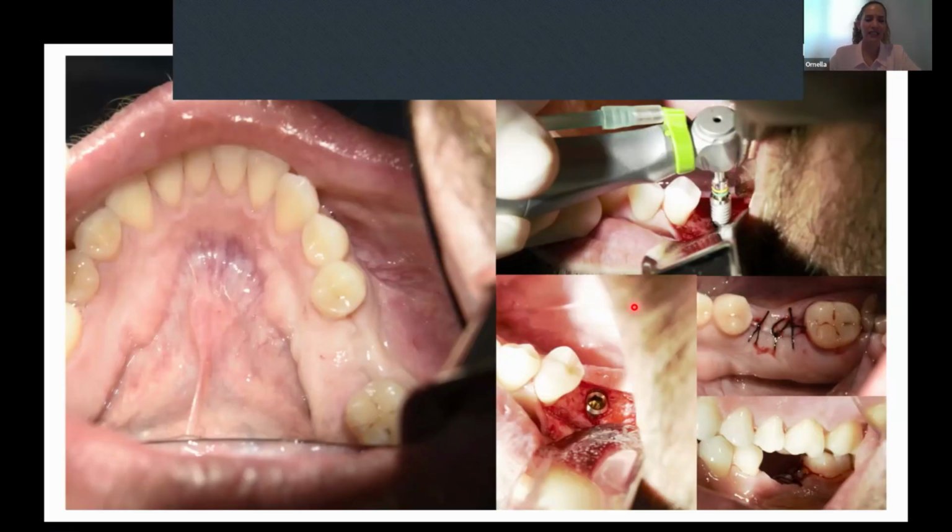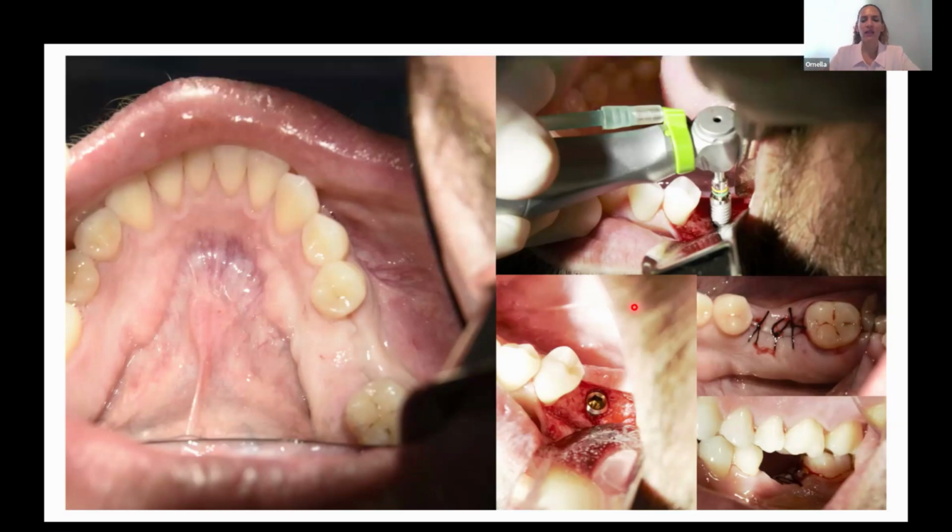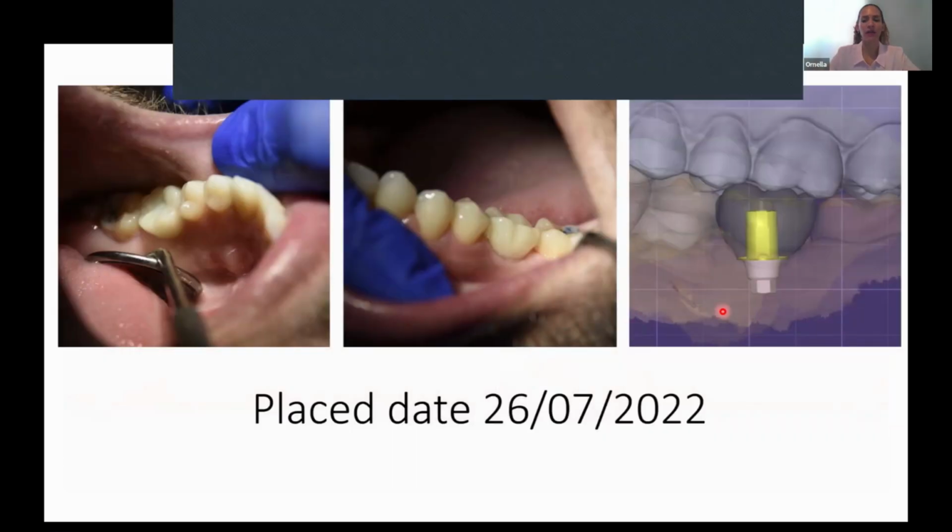This is a clinical case. It's only one crown, but you can see here the implant that is already placed, and we can see that the connection is very submerged in the gum. So the lab, to do a correct design, decided to choose an abutment with the correct height of the gingiva to level up the connection a little bit and then have enough surface for a correct cementation process. So this is going to give us a success case.